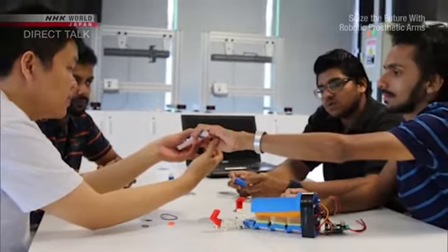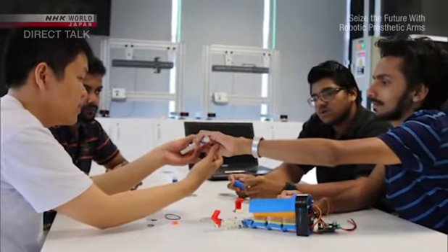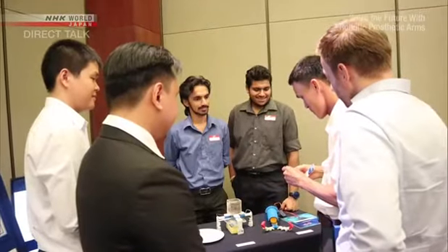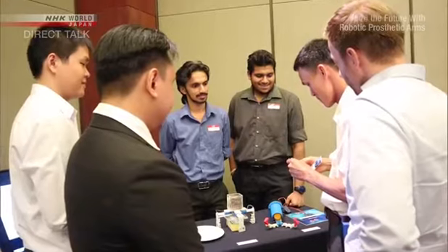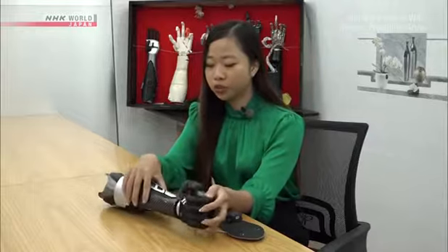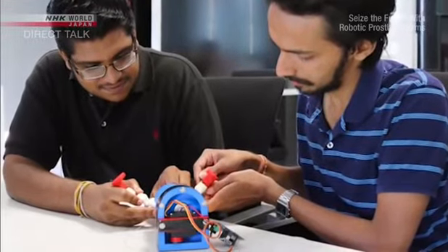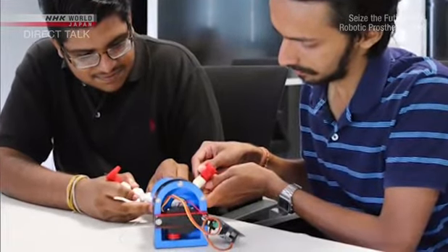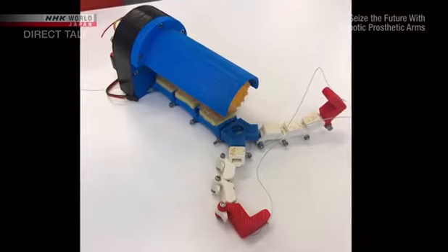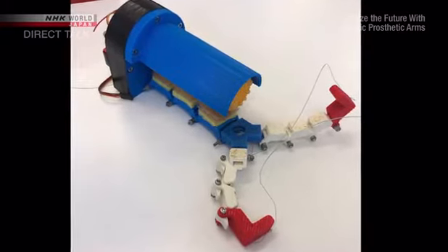In April, Ha's company collaborated with students from RMIT University in Vietnam. Students developed a prosthetic arm module that could help amputees carry out specific tasks. So the students need to talk to different users and do a lot of research to figure out what kind of daily tasks require two hands but an amputee cannot perform yet. And dishwashing is actually a very practical challenge. It actually comes at least 2 or 3 times a day.